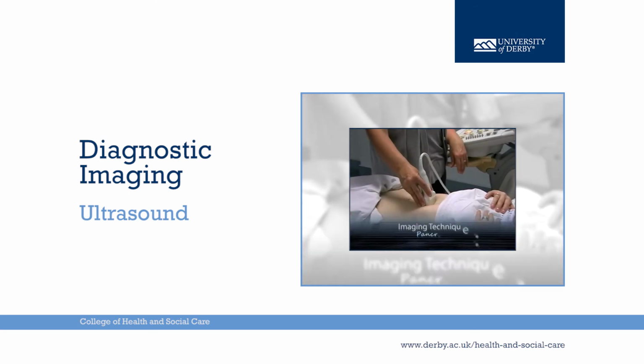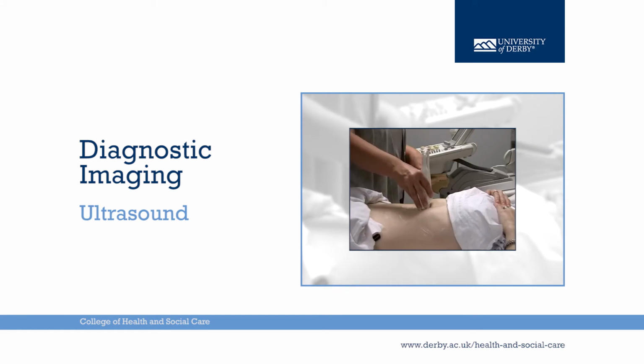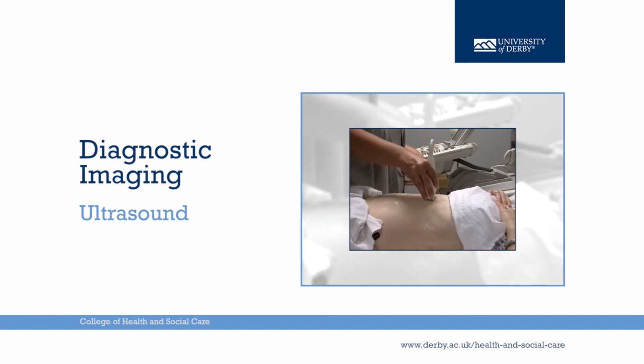Imaging technique of the pancreas. With the transducer placed in the transverse position in the midline of the upper abdomen, the transducer is tilted cranially and caudally. Gentle pressure is applied through the transducer to improve image quality, making small adjustments to its position until the pancreas comes into view. The patient can be asked to push out their abdomen or use the Valsalva technique to help demonstrate as much of the pancreas as possible.